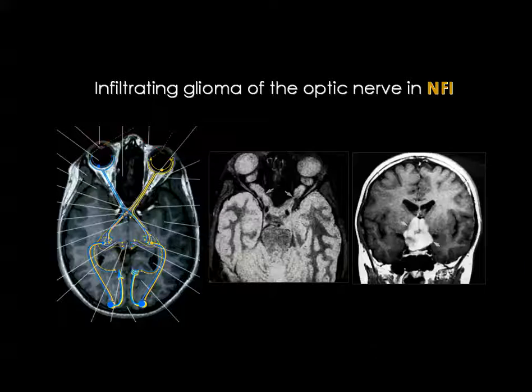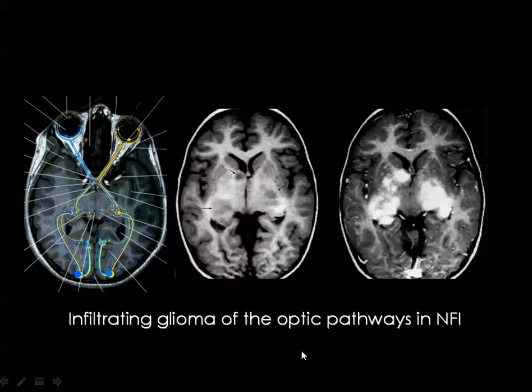If the patient has other stigmata, زي ان هو يكون عنده optic nerve glioma او يكون عنده glioma along the visual pathways، ولكن ممكن الهايبوثالاميك glioma تبقى لوحدها بس، اللي هي the tumor which is homogeneously enhanced in the suprasellar area, no cystic component, and occurring in the pediatric age group. And this is, of course, gliomas in the course of neurofibromatosis type 1.